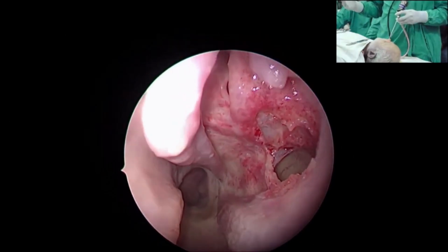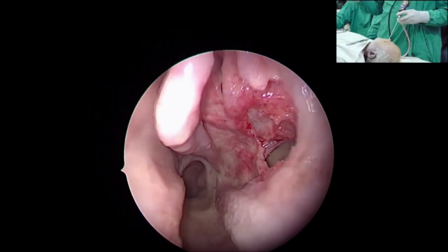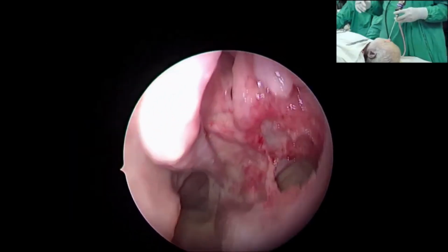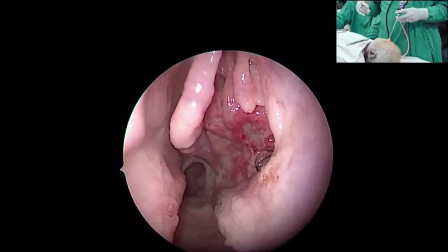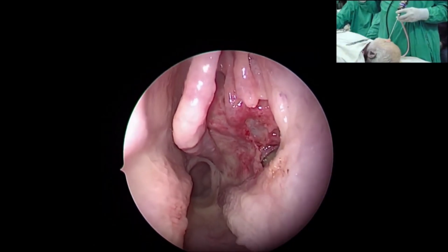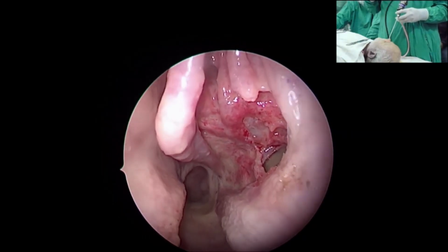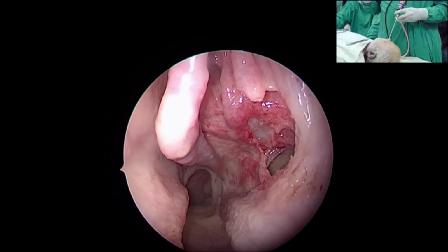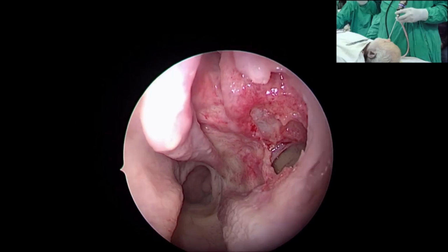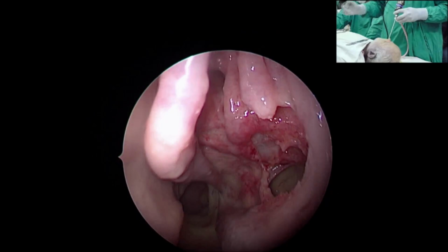With more and more advancement in surgical technique, instrumentation, equipment, image-guided surgery, and radiology, I can attribute this advancement to so many things which have now made the endoscopic approach the preferred approach for addressing so many things. So we need to understand the three-dimensional anatomy of the entire region. And that's why I believe this science of endoscopic surgery is the fastest growing subspecialty in the entire medical science now, as more and more indications and applications are expanding.